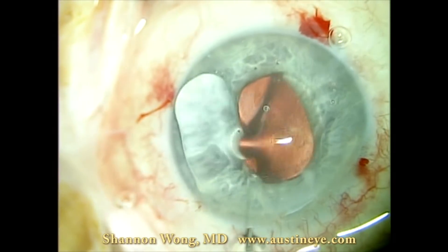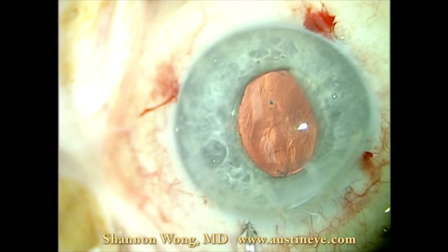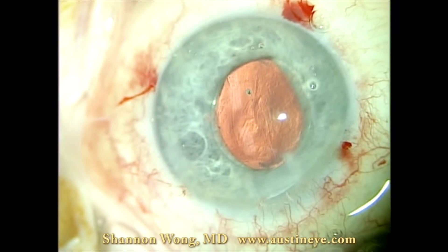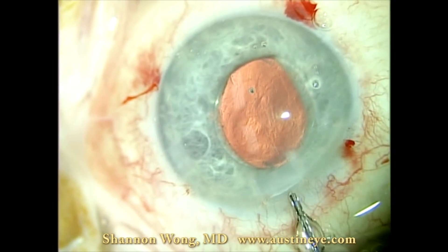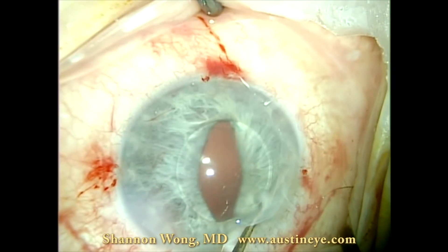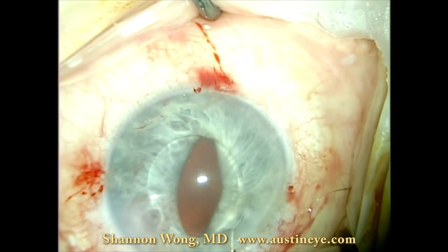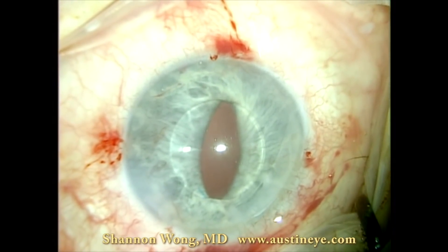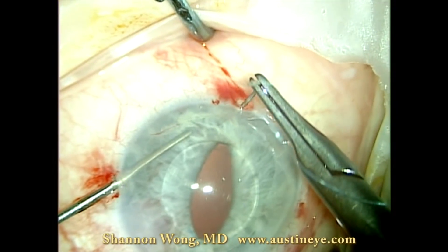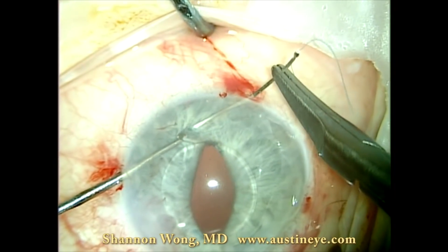We use a generous amount of viscoelastic to protect the corneal endothelium. Here we're introducing the miotic agent. As you can see, the pupil comes down nicely, and then we position the lens implant so that we know exactly where the haptics are below the iris. We use a 10-0 nylon suture on a long needle, and we provide counter traction with a micro-instrument — in this case, a Lester pusher.